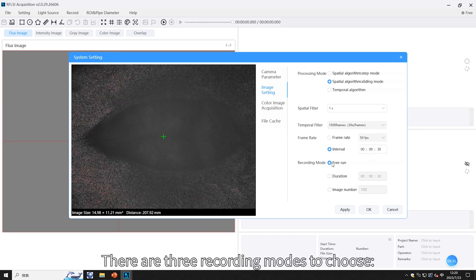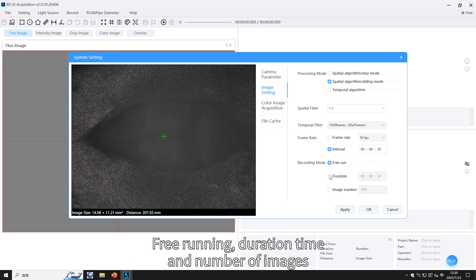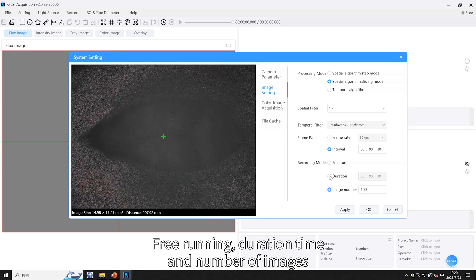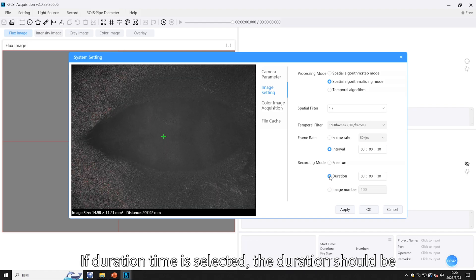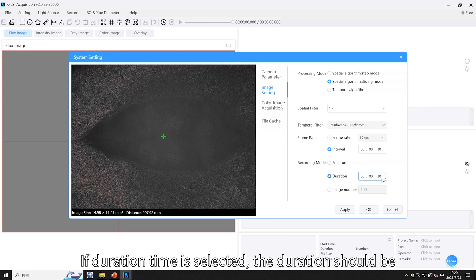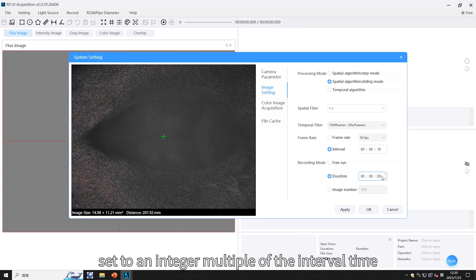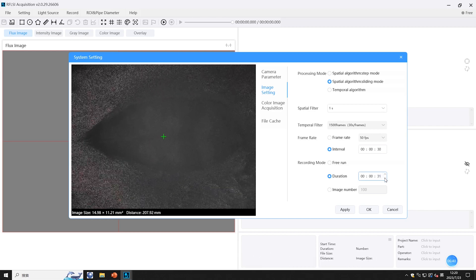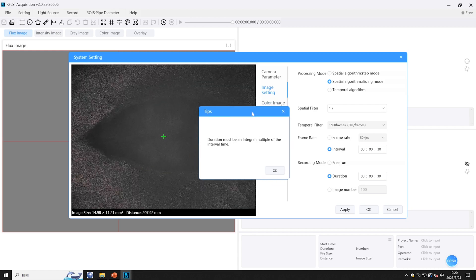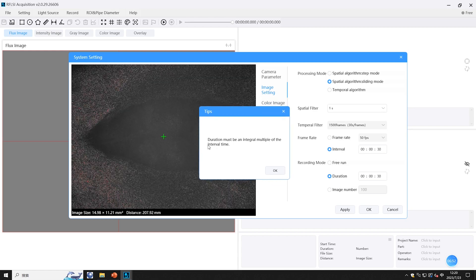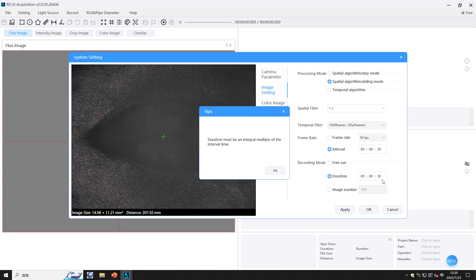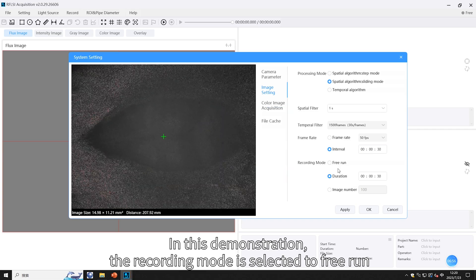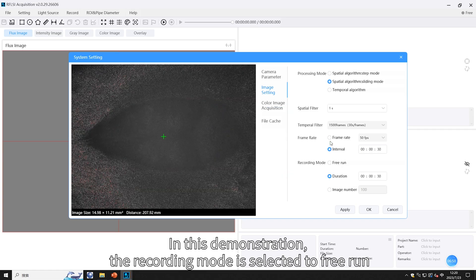There are three recording modes to choose from: free running, duration time, and number of images. If duration time is selected, the duration should be set to an integer multiple of the interval time. In this demonstration, the recording mode is set to free run.